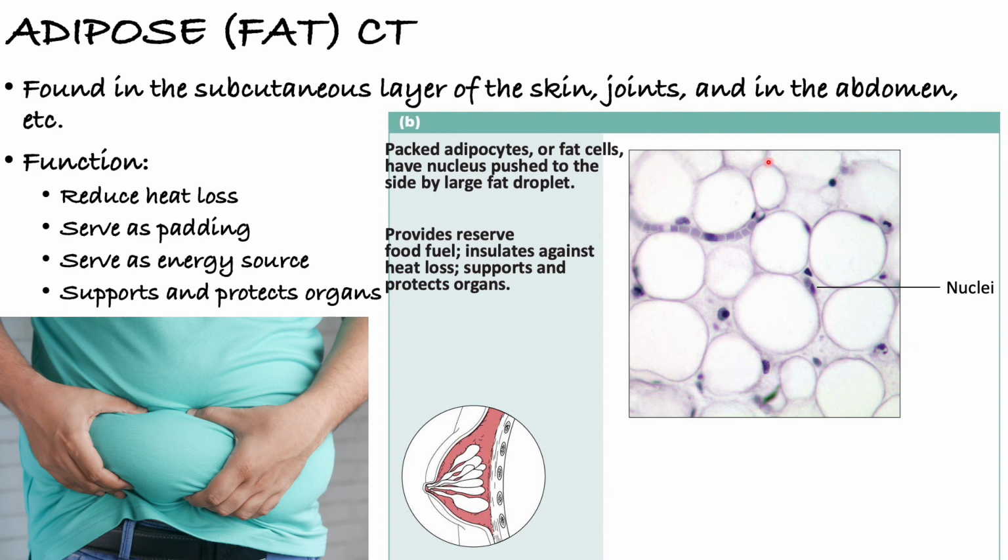So in this histological picture, we can see that adipose tissue is going to look like white bubbles. All right, so no one should see this and say, wait, is this epithelial tissue? Is it areolar? No. White bubbles with their nuclei, this purple thing right here, pushed to the sides. And this is very unique.